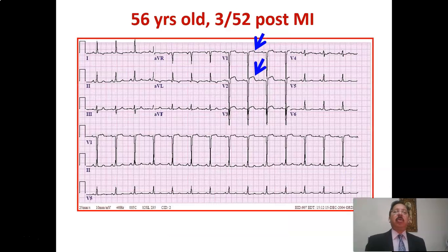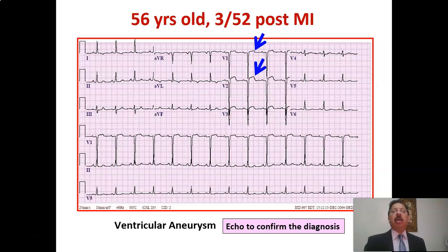This is a 56-year-old who presents 3 weeks post myocardial infarction, and you see ST segment elevation is still there in V1 and V2. So what you are going to do is echocardiography, and it will be confirmed.